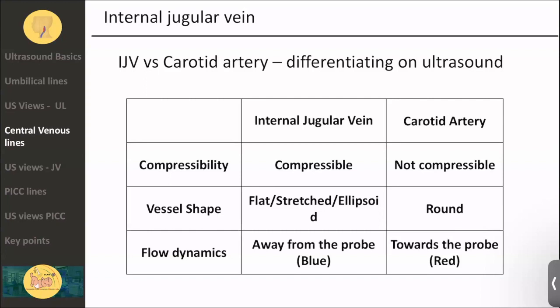The jugular vein, now we have started putting it. It's very, very easy to put. Not as easy as it is sounding, but however, under ultrasound guidance, it can be put. There will be a station on the blue phantom where you will be tracking the needle, and Sumesh will be taking that station. So for the purpose of presentation, how do we differentiate between the vein and the artery?